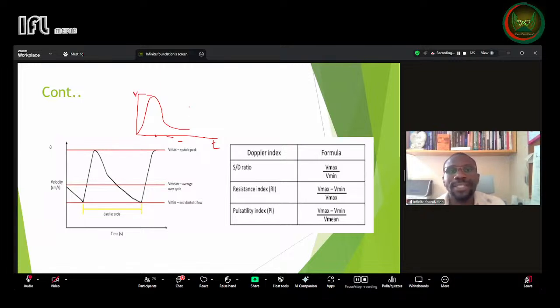It's a little bit complicated because you need to calculate the mean velocity from delta x, that is the change in distance from where the wave is starting, so you get that average against that time minus the velocity at t.